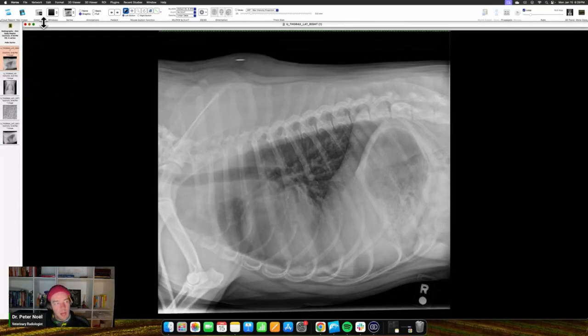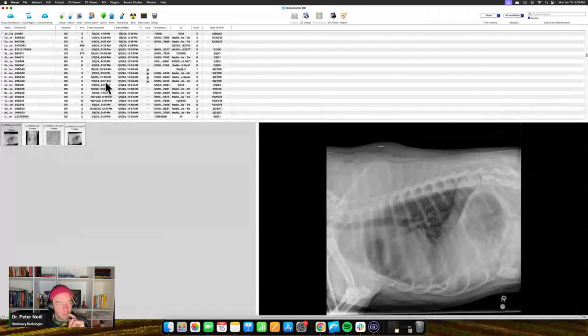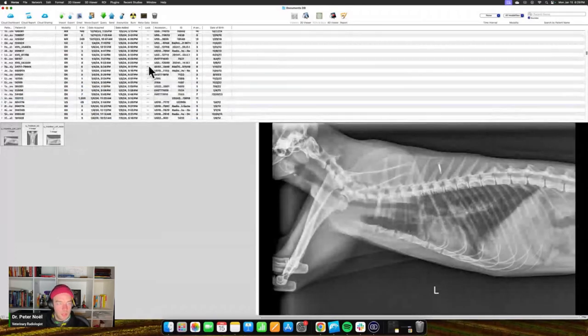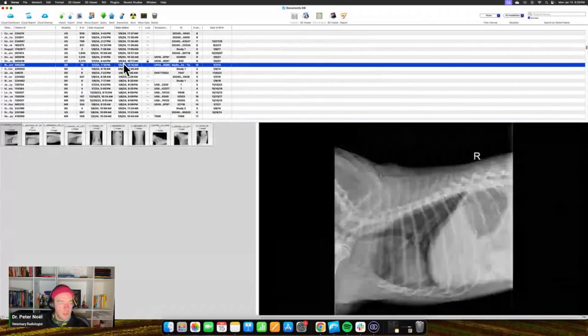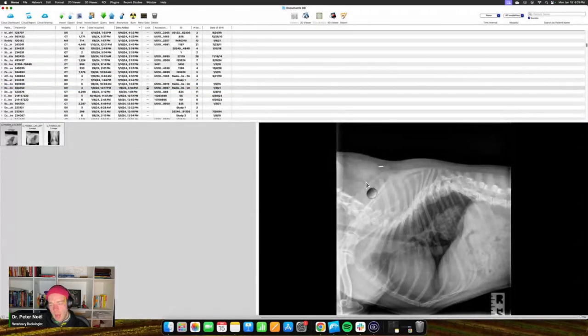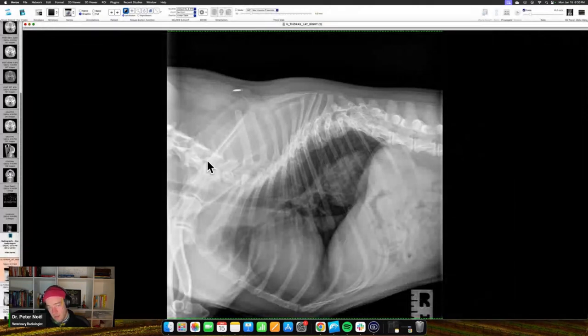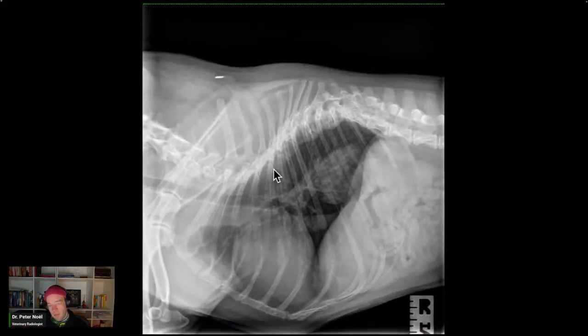How would I describe the spine? As a mess. I would describe the spine as completely normal for this dog. So here's how I would describe the spine. Where'd that go? So I would describe this spine, right? If they give me the history, I'm hoping they don't give me the history of a T3-L3 myelopathy. If they don't give me a history that relates to the spine, then I would sort of blow this off.